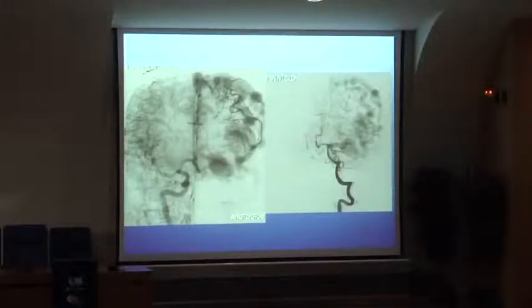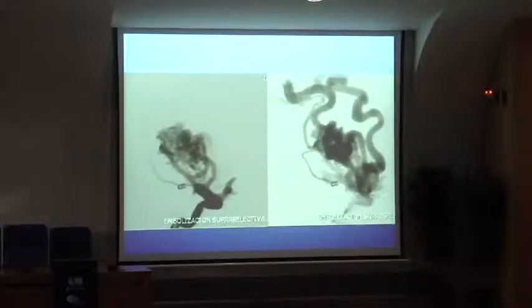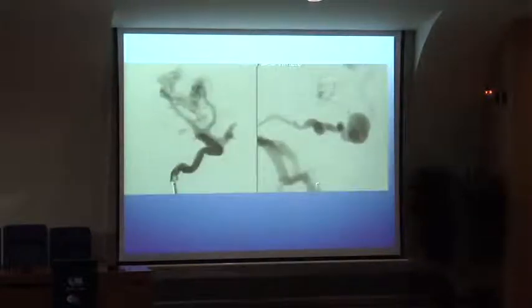You have the high flow fistula. This is important because you know the leptomeningeal anastomoses to the anterior cerebral artery and the posterior cerebral artery are still open. Next, this is the fistula, the high flow fistula. And then in lateral view, I first put one catheter with coils in the feeder. These coils are fiber coils. They are not standard coils, they are Nexus fiber coils, because they are more thrombogenic.